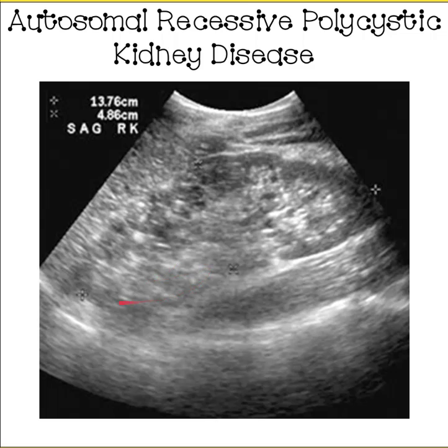So again, we can see there aren't cysts like what we would expect, and that's because they're just itty bitty tiny cysts. Physics of ultrasound doesn't allow us to see 1 millimeter, 2 millimeter structures usually, unless you're using a very high frequency. And so these tiny, tiny little cysts just kind of all blend together, and all we see is the through transmission because there are so many tiny little fluid-filled pockets in there.